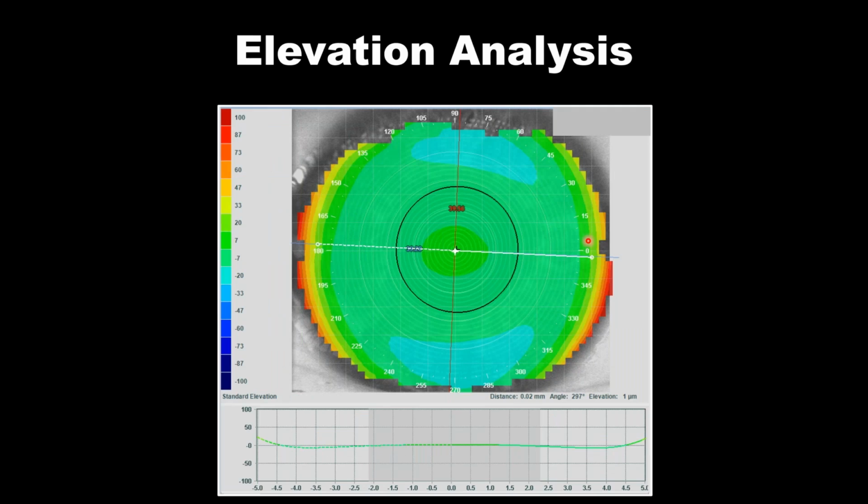The elevation is used to understand height. So where your rigid contact lens will land hardest is where the eye has the most elevation, and that's the red that you see on opposing sides here at 3 and 9 o'clock. Whereas the blue is where the elevation of the eye begins to drop, or the corneal elevation is changing in a negative manner, so we're losing height. That would mean that blue is where you should have pooling if we place a lens on this eye.